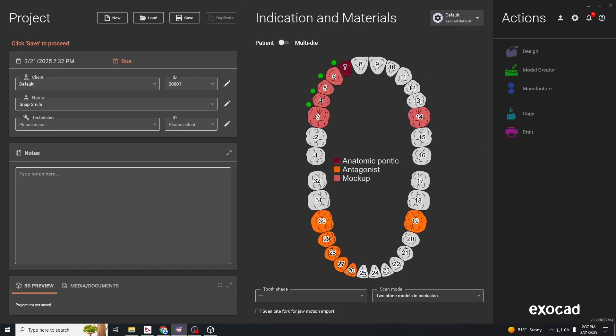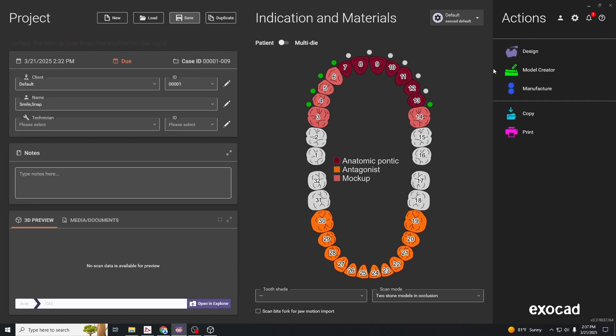If you hold down shift and click to the opposite end of the edentulous segment, it'll select everything in between. We're going to click on the green dots to turn off the connectors for the anatomic pontics, because we'll have the soft tissue there that'll link everything together.